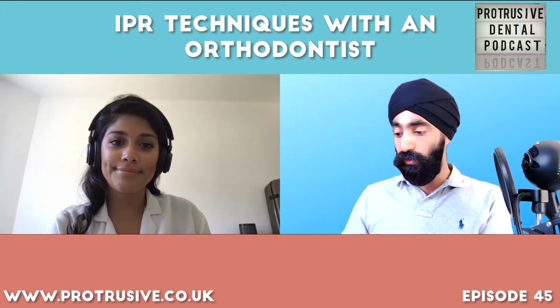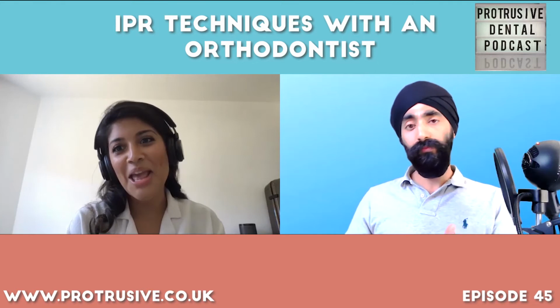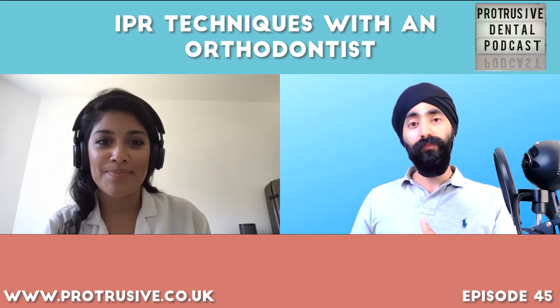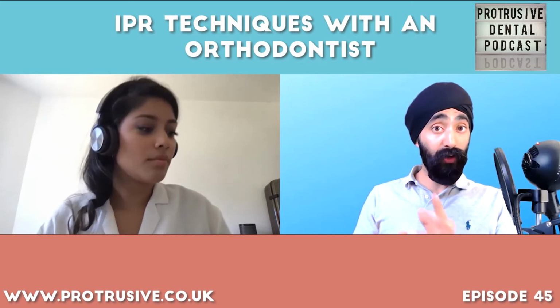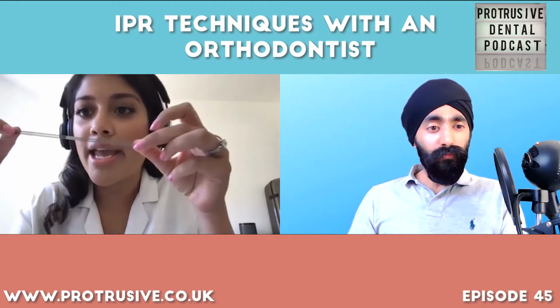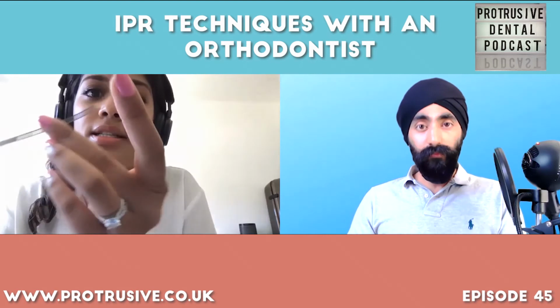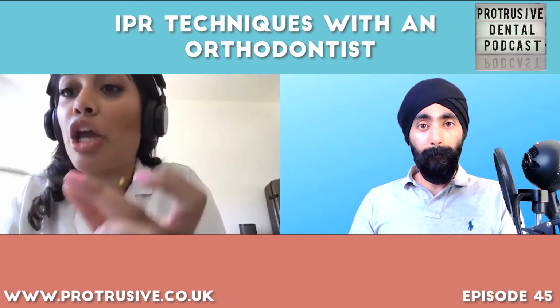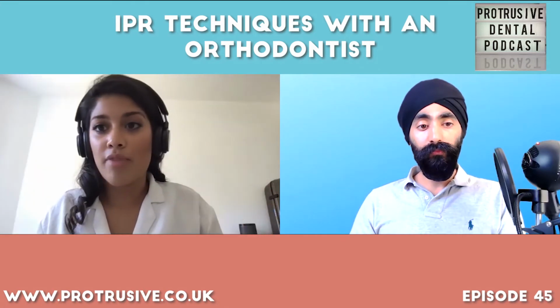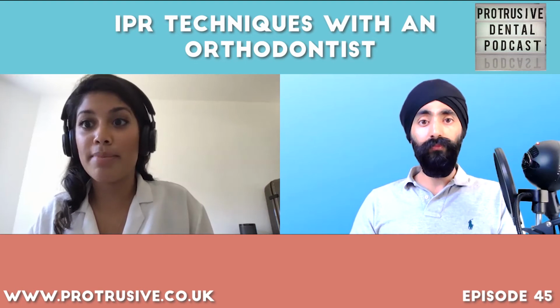Brilliant. So now we touched on the 3 methods of IPR. Which do you prefer? I personally prefer the abrasive, the diamond strips. Can you show the listeners which ones? Yeah, sure. So I normally buy an assortment. This is single-sided diamond, and the color is yellow. Here we go. This is the finest. It's extra fine. It's then followed by red, which is fine, and then blue, which is medium.